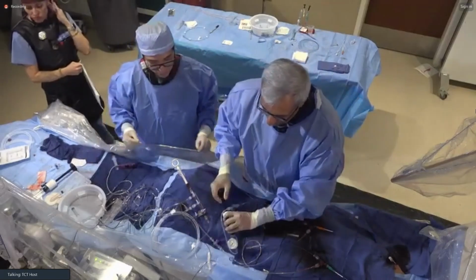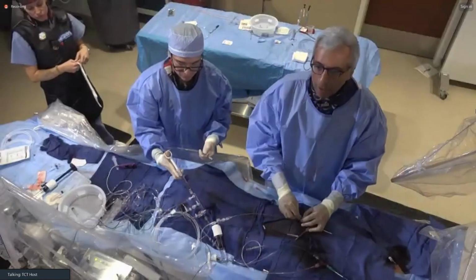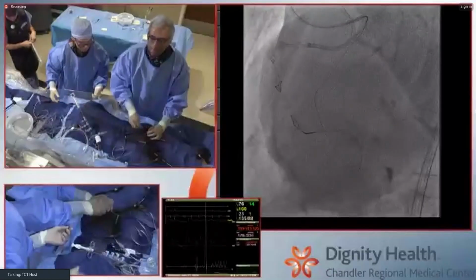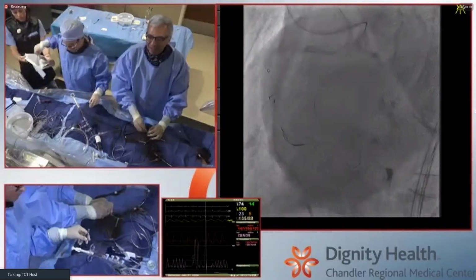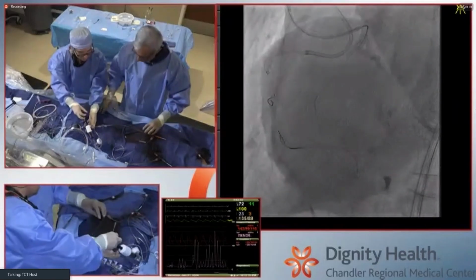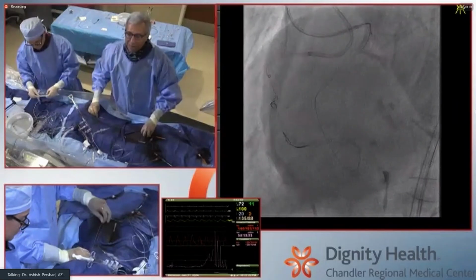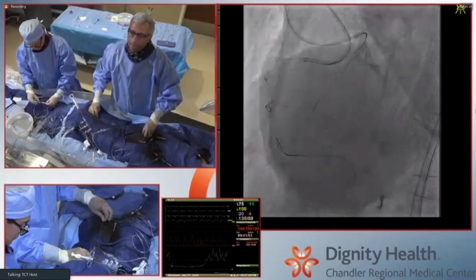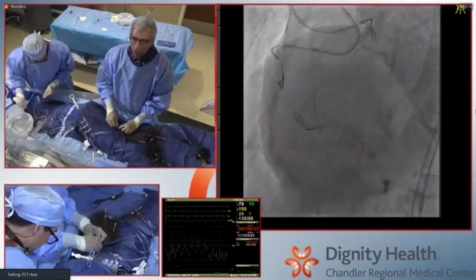Or you go to a Confianza Pro 12 or one of these other penetrative wires where it's almost one-to-one torque control, lots of penetrative power, but you're using it only to cross between your connection point and your trap liner, so you're not actually wiring with the wire. So Ashish, have you given any consideration to putting a second wire through that trap liner before you put that down, thinking you might need a base?